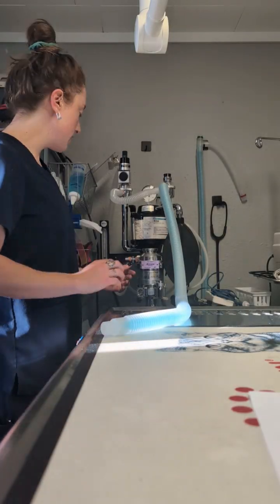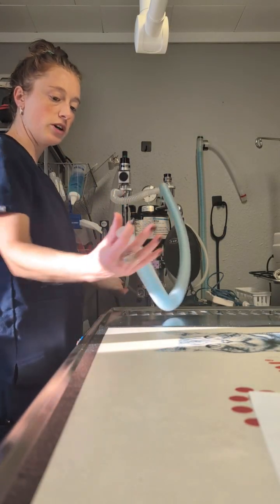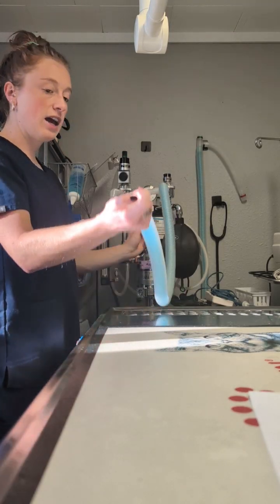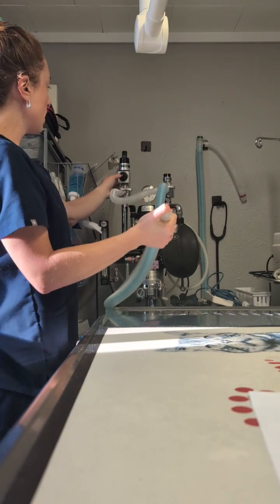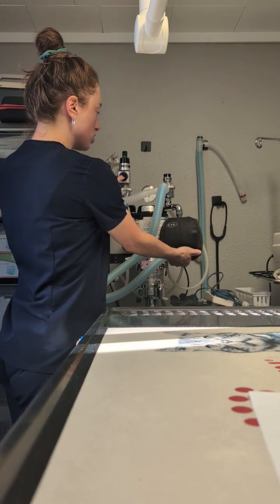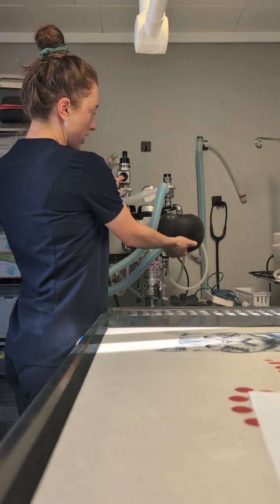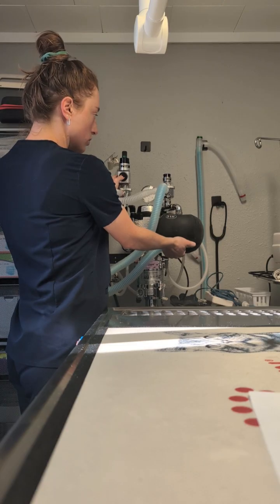To perform a leak test, I want to make sure I have oxygen in the system. So I'm going to add some oxygen into the reservoir bag, and I'm going to hold the patient end of the tubing. I'm going to use the occlusion button just to prevent any gases from escaping. And then I'm going to put some pressure on the reservoir bag and make sure that I don't hear any air escaping or see the manometer go down in pressure.